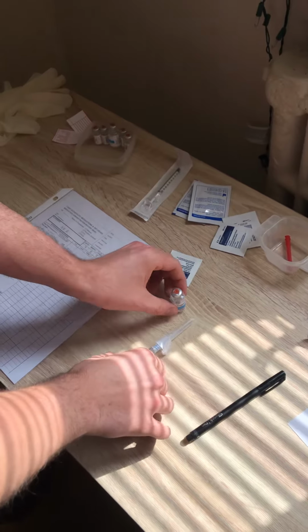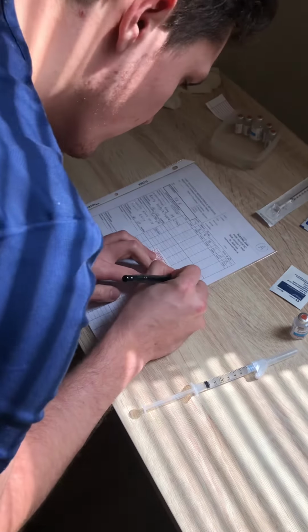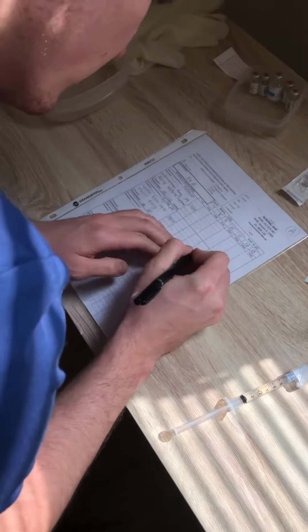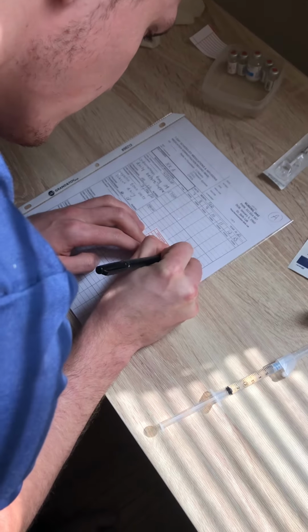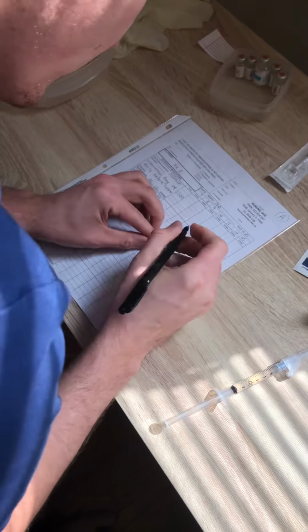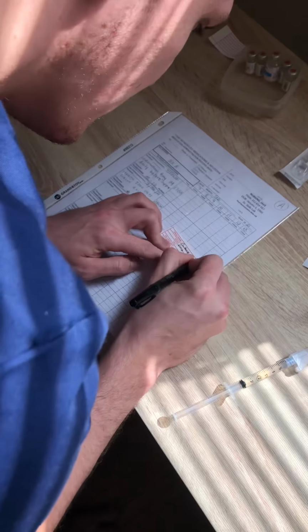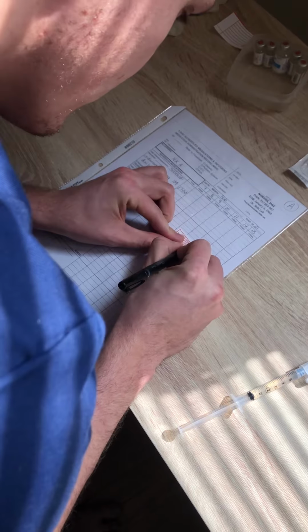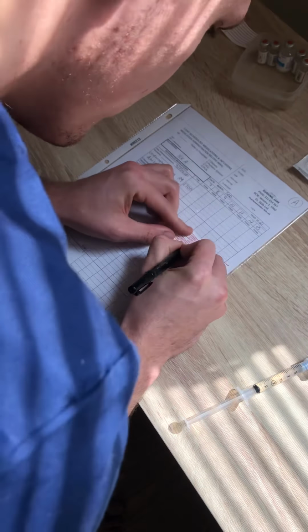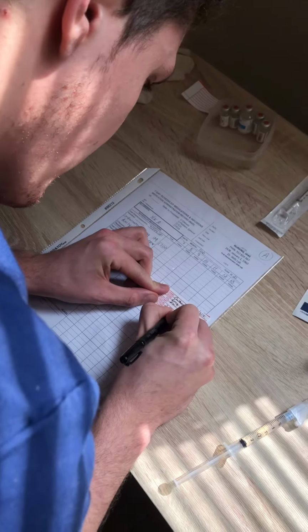So now I'm going to do up my med label immediately. So for right patient of nursing Jake, drug name ondansetron. Dose is 6 milligrams, and this is going to be intramuscular. Volume is 3 ml because the concentration is 2 milligrams per 1 ml.